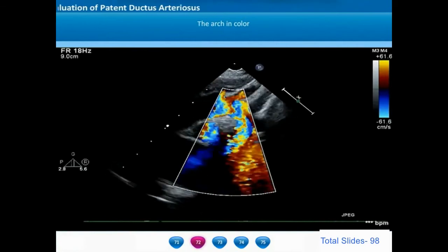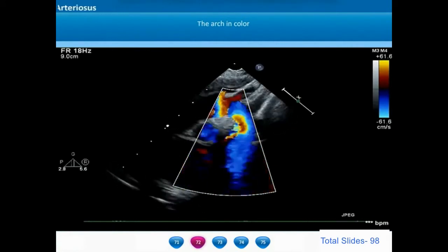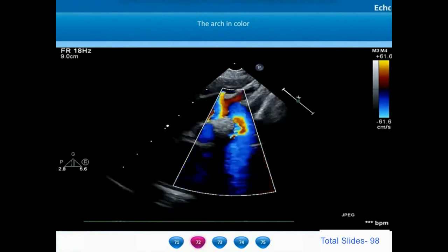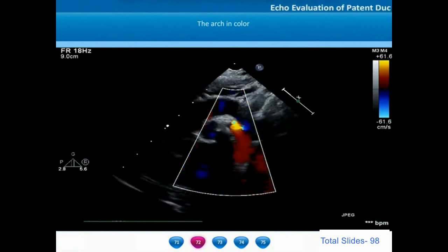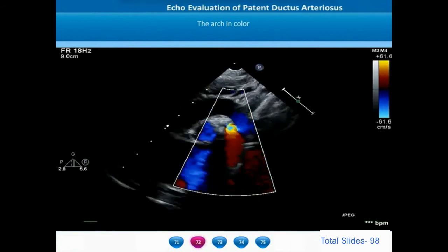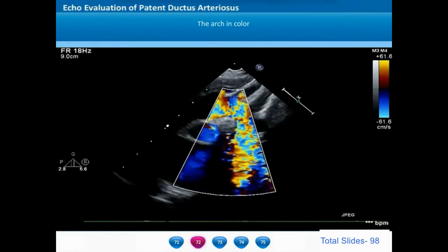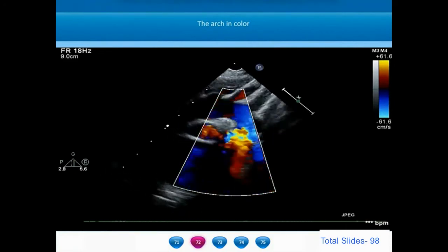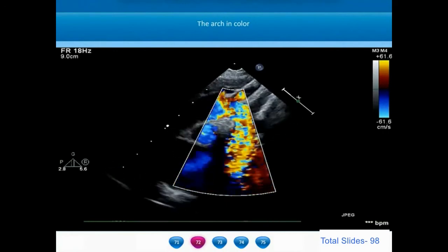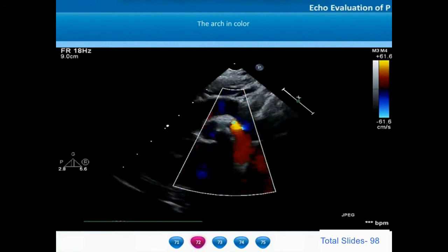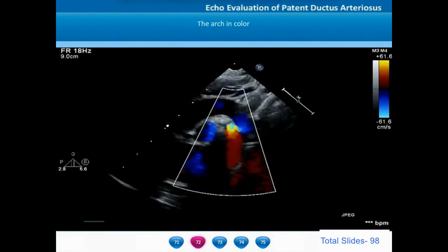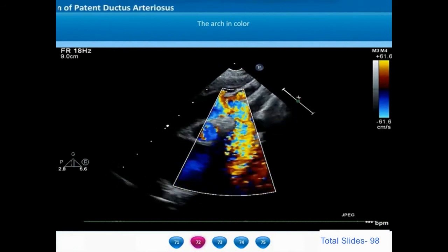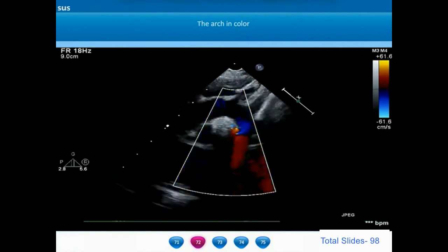The suprasternal long axis view along the aortic arch shows the entire ascending aorta, arch, and descending aorta with the arch branches. We can notice the flow convergence of blood in diastole from the arch of the aorta and the descending thoracic aorta towards the aortic end of the ductus arteriosus. Blood in the descending thoracic aorta reverses towards the aortic end of the ductus, and blood in the aortic arch flows towards the aortic end — causing convergence of a blue color from the distal aortic arch and red color from the proximal thoracic aorta towards the aortic end of the ductus.